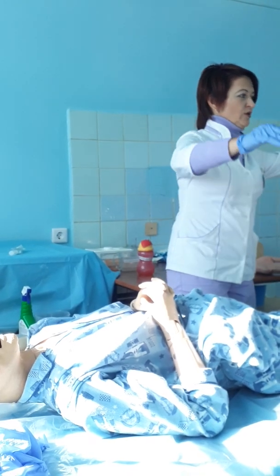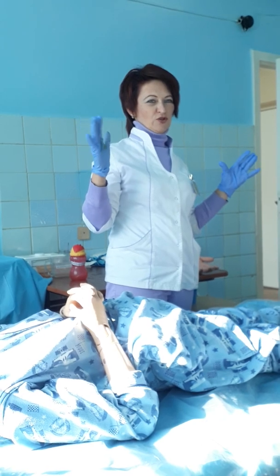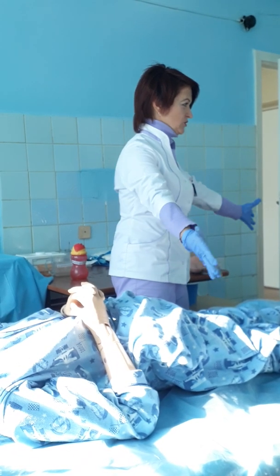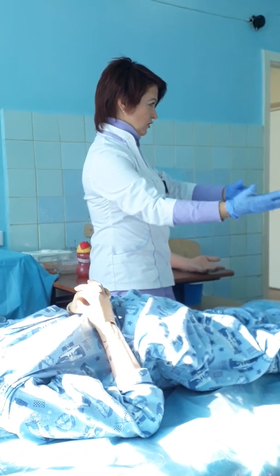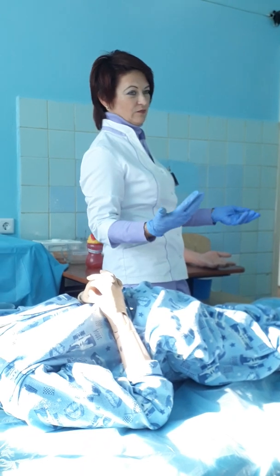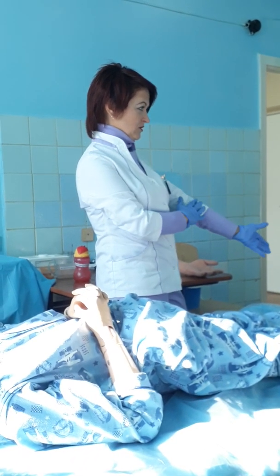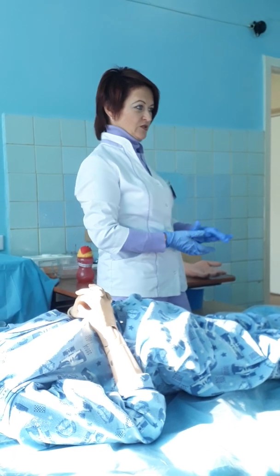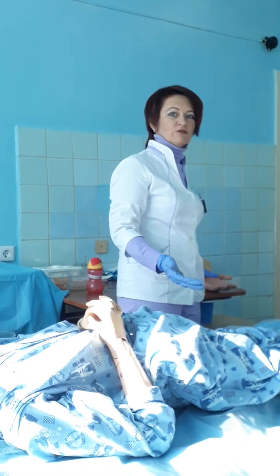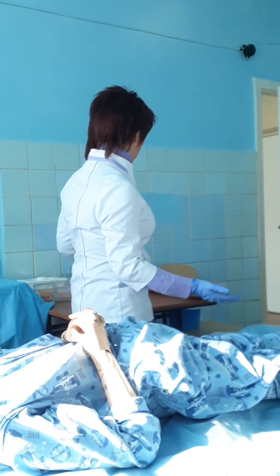You ask your patient, please show me the place for injection. If it's ulnar venous, remove the clothes, show me, and you can check both arms. You look at his arm and palpate it and ask, please sit down, I will give this injection in this arm. Your patient sits on the chair.